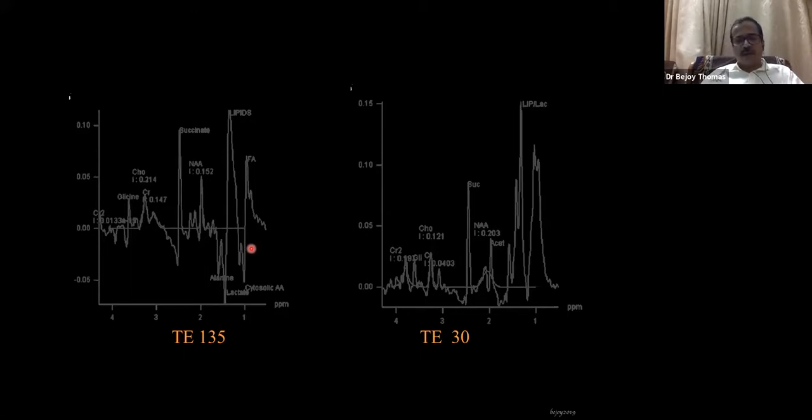It is not a staphylococcal abscess, because you are seeing cytosolic amino acids. In staphylococcal abscesses, you will not see much of the cytosolic amino acids. So cytosolic amino acid is your friend. When it is present, you should always think, even after antibiotic therapy, it can actually persist. You have to think of pyogenic abscess.